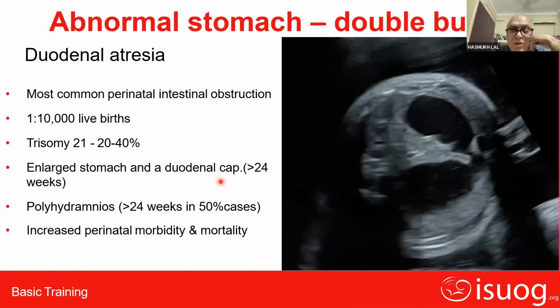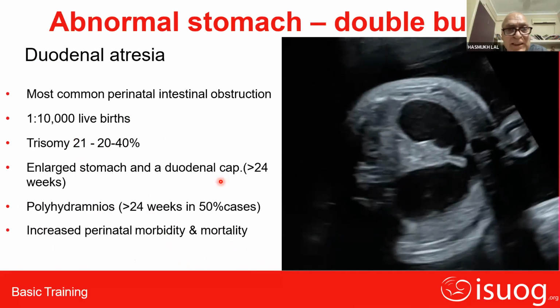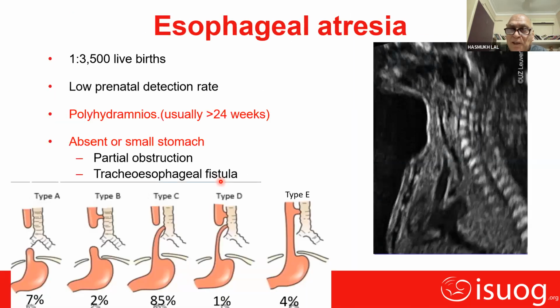Yeah, Dr. Suchita, please describe the ultrasound features of fistula. Previous slide, yeah, this pouch sign. Please explain. Yeah. So actually, then we have to explain about the 4 lines of esophagus. Sir, I didn't bring that slide, sir. I thought it would be a detailed examination.